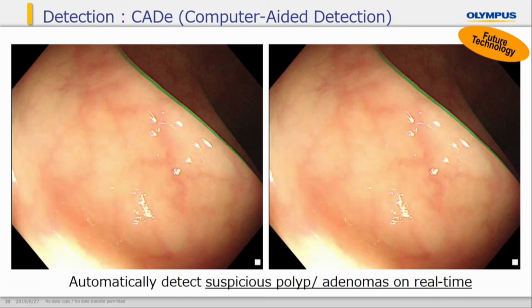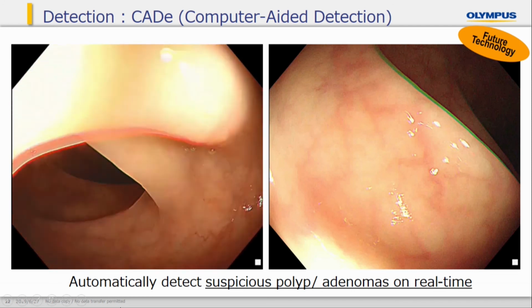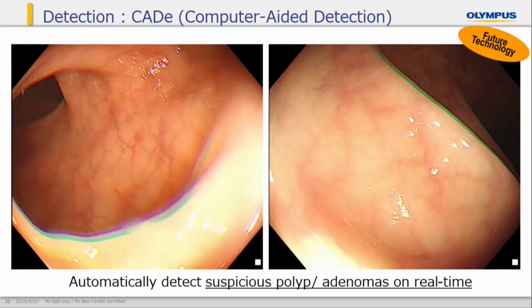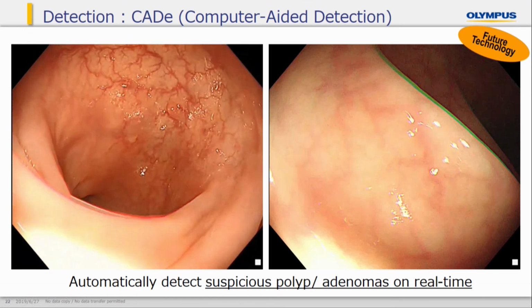Today, I have prepared two movies. One is without CAD, and the other is with CAD. Please try to identify the suspicious polyp or neoplasia. First, I will show you the movie without the CAD function.